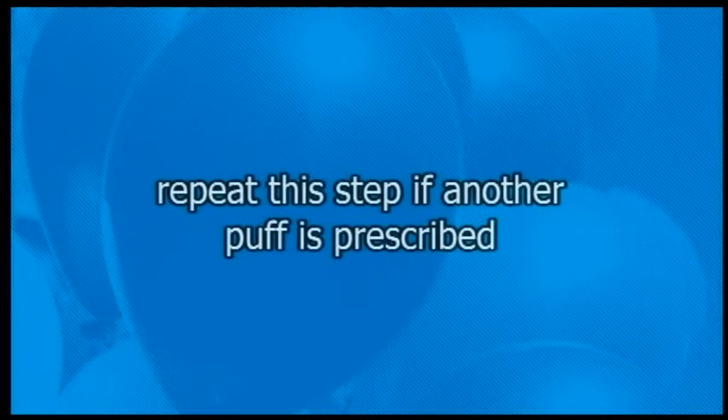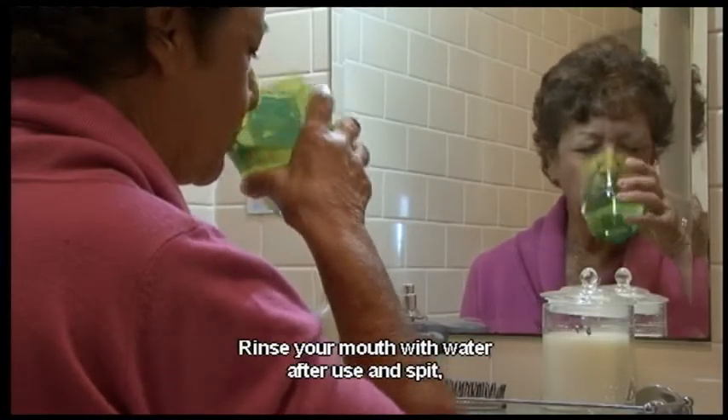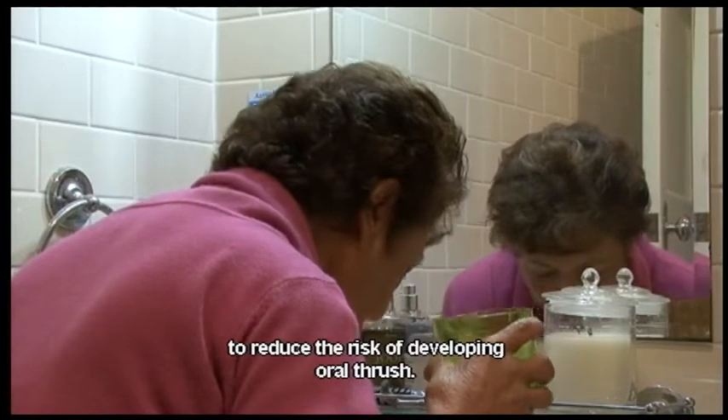Repeat this step if another puff is prescribed. There is no need to wait between puffs. Rinse your mouth with water after use and spit to reduce the risk of developing oral thrush.